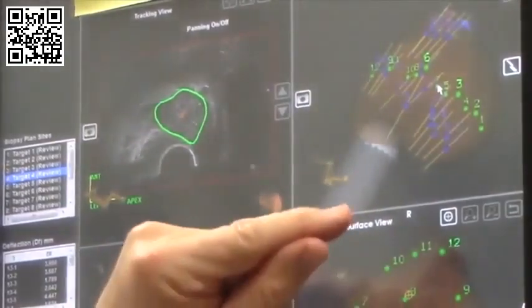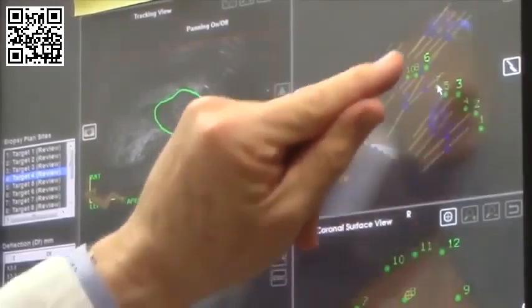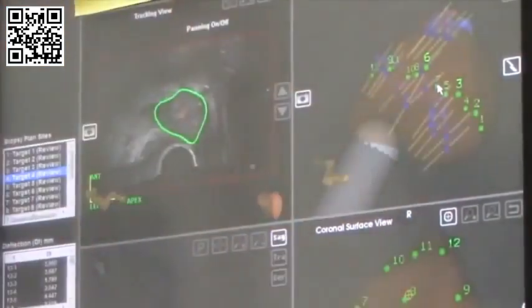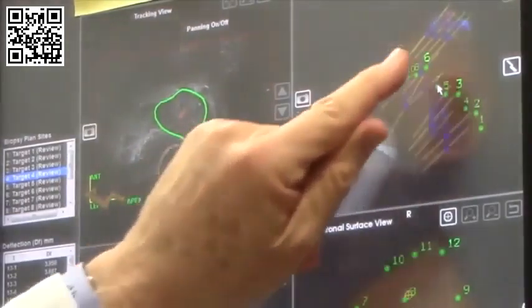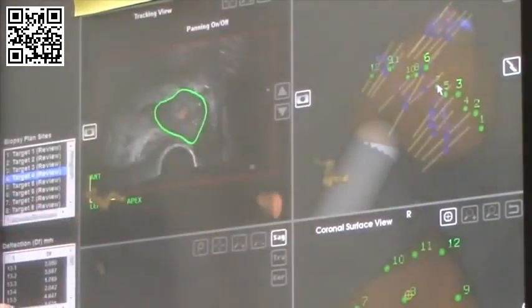This individual had a conventional prostate biopsy previously, showed nothing, PSA continued to elevate, and we brought him in, got the MRI, which was interpreted by the radiologist, delineated here on the MRI, and then brought into this clinic, fused with real-time ultrasound, and served as a target for targeted prostate biopsy, allowing us to obtain tissue from a part of the prostate that is usually not sampled.